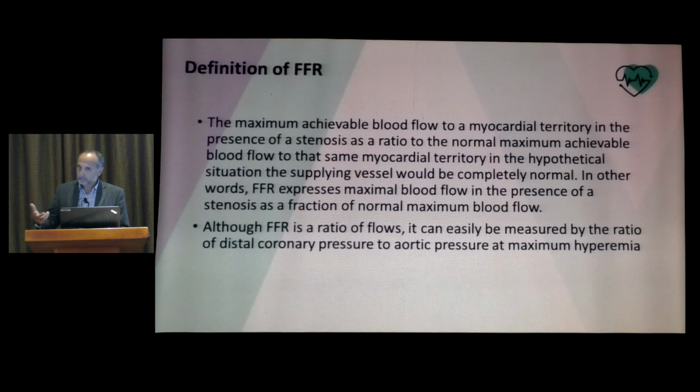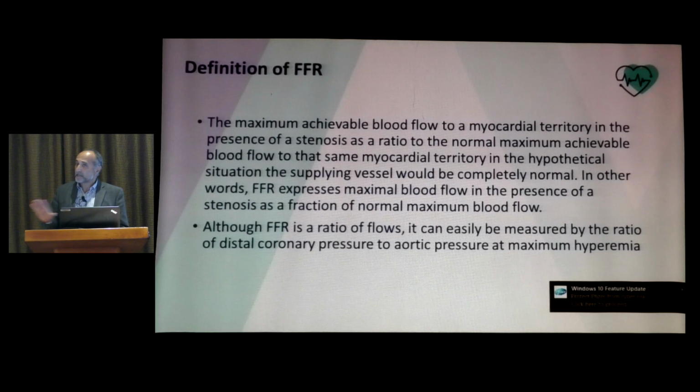When we want to evaluate a lesion, what we typically do non-invasively is an exercise test. With an exercise test, you exercise the patient, you increase the flow, and then you can assess the impact of that lesion on ischemia when you achieve maximal exercise. If there are no symptoms and no changes on the ECG, then you can safely assume, as long as you have reached maximum exercise, that this lesion is not ischemic. So you tend to leave that patient alone.